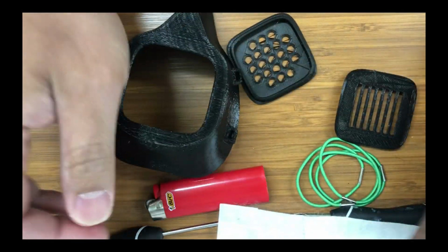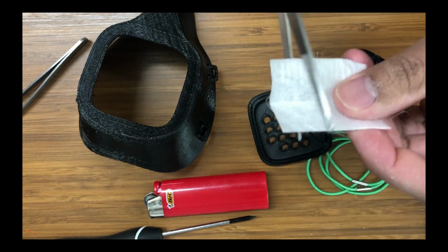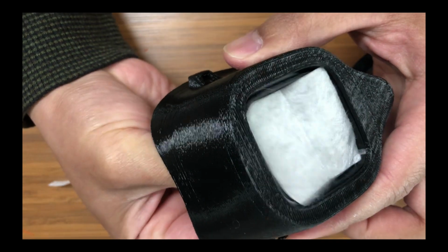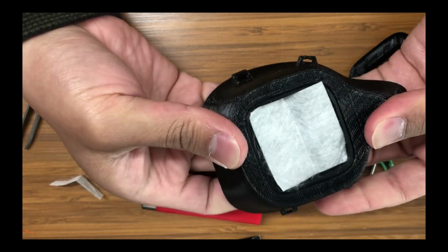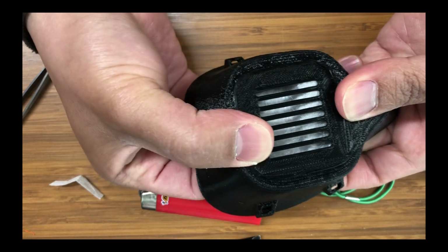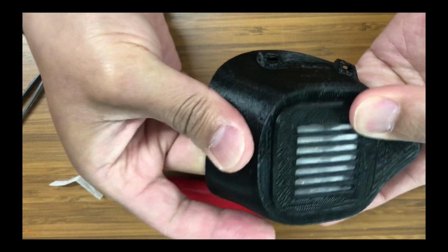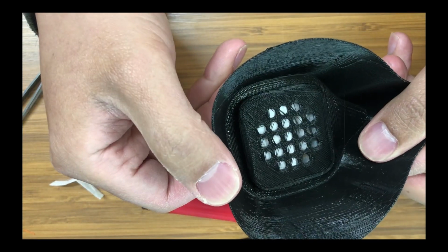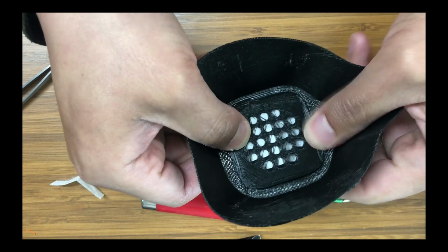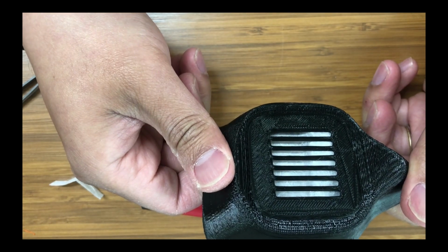Now what we want to do is measure our filter, so we're going to cut that out. Okay. All right, so now we're going to put this on the inside of the face mask with the piece of filter like this, and then I'm going to put this right here, and then all I got to do is snap it together and it should fit. There you have it. Move it around so that way you can make sure that the fit is tight.